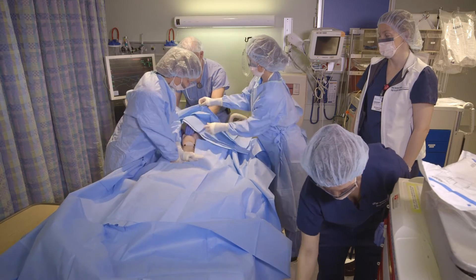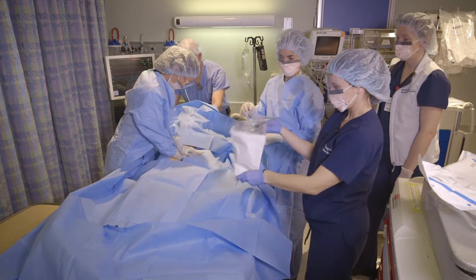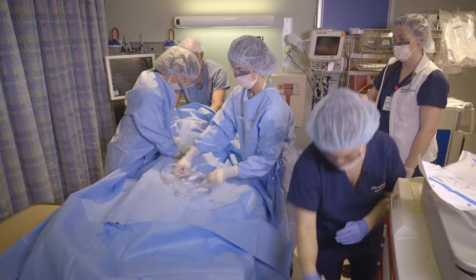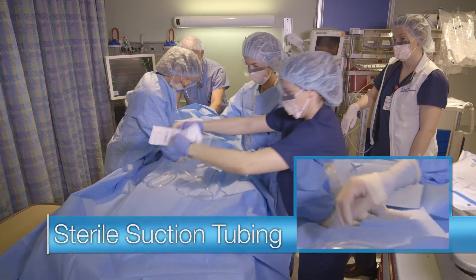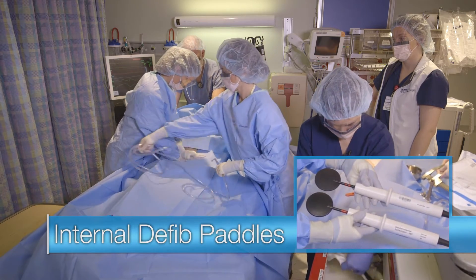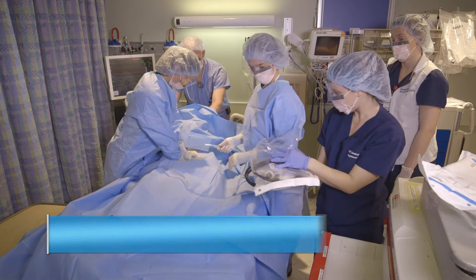At this point, the patient is prepped and ready for sternal reopening. The tamponade nurse remains with the supplies, placing necessary items onto the sterile field. Most importantly: sterile suction tubing, Yankauer, and internal defibrillator paddles, ready to drop a scalpel on the field when a provider is ready.